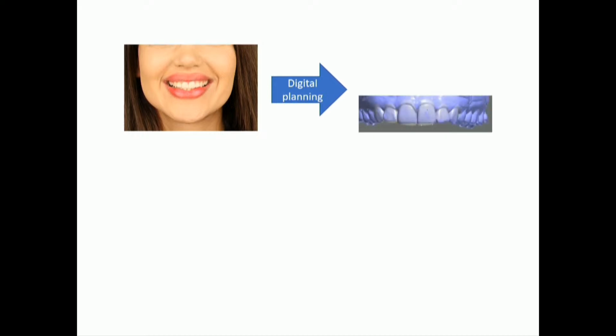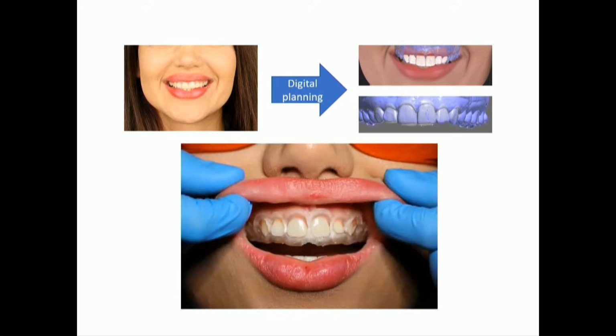Another case with the amazing Dr. Mahdi. Patient came to us, remember? She had short crowns. We proposed crown lengthening. So what we did, planned it digitally. And then we proposed the design for her. We told her, you know what? We want your teeth to look like that, but we need to do crown lengthening. And we need to follow the crown lengthening exactly the same way that our final prosthesis is going to be, right? So we measured that, and we created a crown lengthening guide.